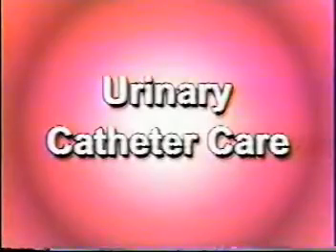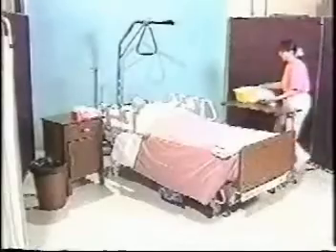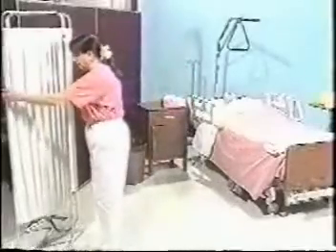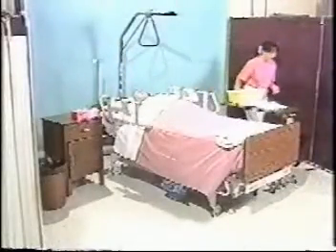Urinary catheter care. Begin by washing your hands. Gather needed supplies. Provide for privacy. Put on your gloves and elevate the bed to a comfortable working height.